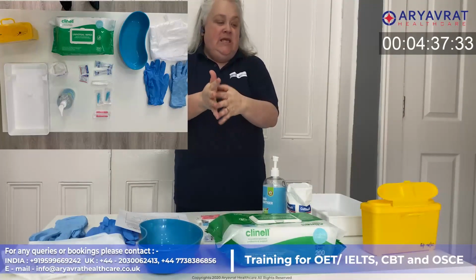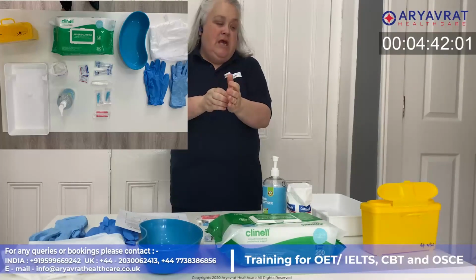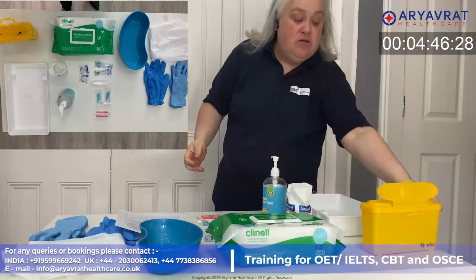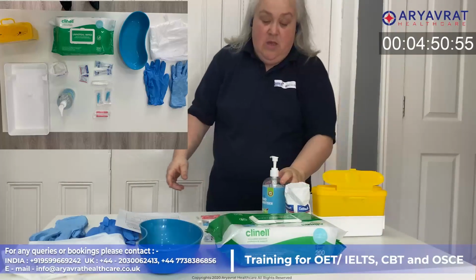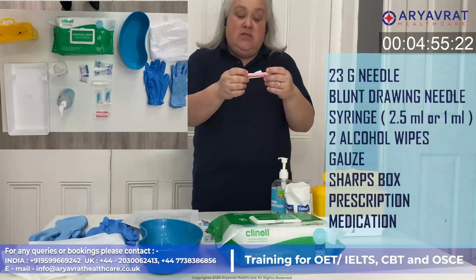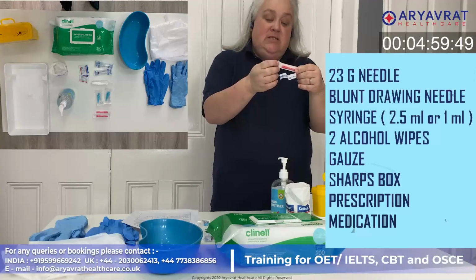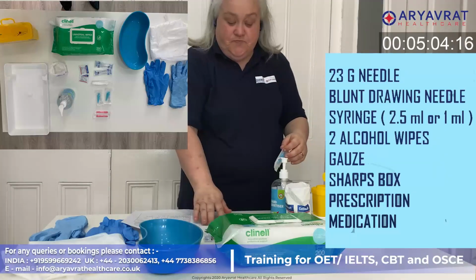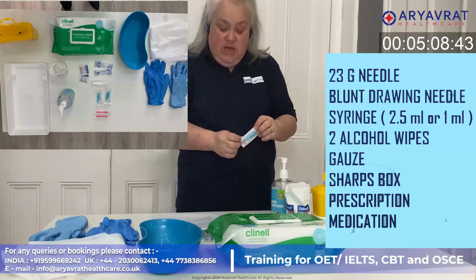I'm going to need a sharps box which has been assembled and signed, and making sure that it's not overfull. This one's fine. I will need a blunt drawing needle which is intact and in date, October 25. I will need either a 21 or 23 gauge needle.